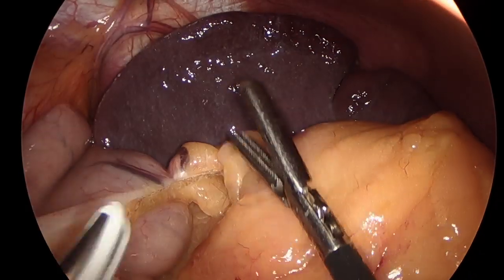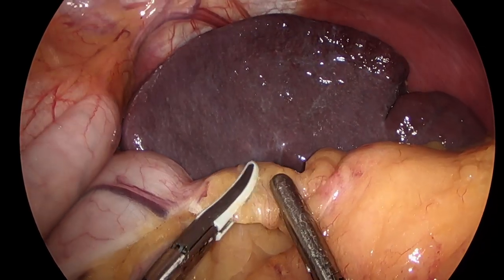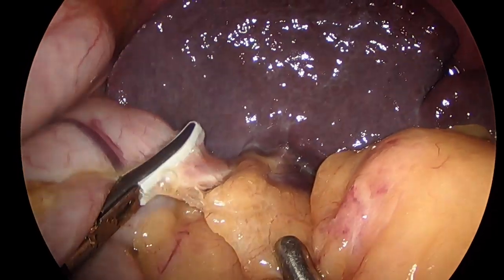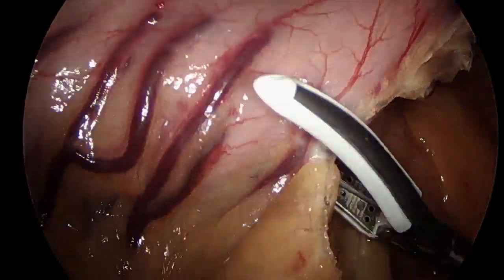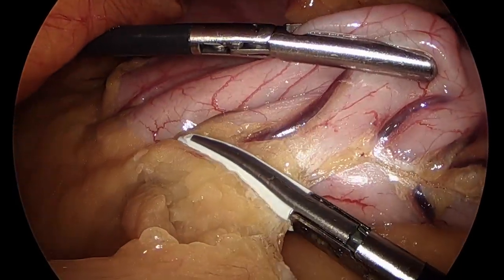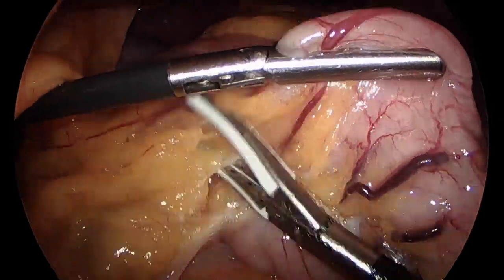This also allows easier removal of the specimen at the end of the operation. As the spleen is approached, we double burn to ensure hemostasis of the short gastric vessels. The cut function is triggered after our second burn medially. There may also be posterior attachments that require additional dissection; however, care must be taken to avoid dissecting deep posteriorly and dividing branches of the left gastric artery, which supplies the gastric sleeve. Once the spleen has been reached, we turn our attention to the inferior greater curvature attachments, working towards the pylorus. Care is taken not to dissect too deeply in this plane, as you can go through the transverse colon mesentery and enter the infracolic space, which can also create a potential internal hernia site.